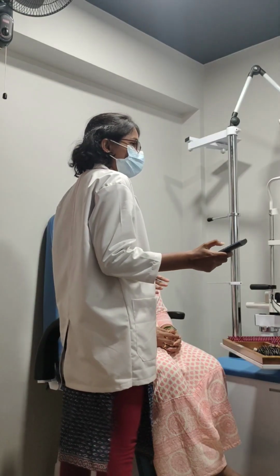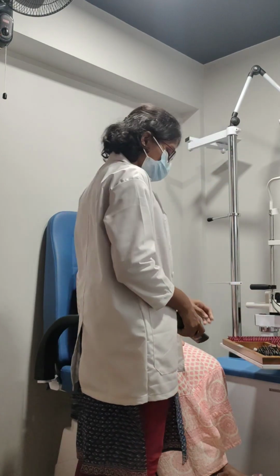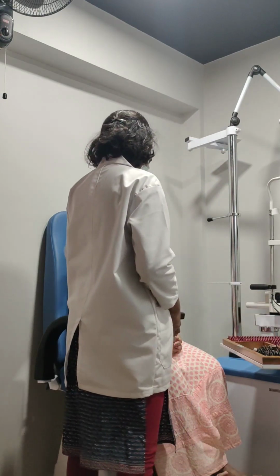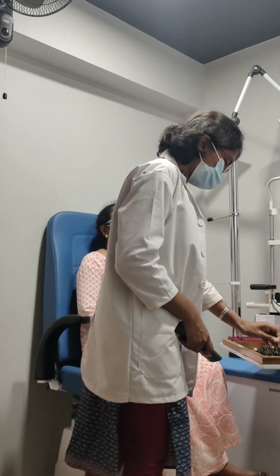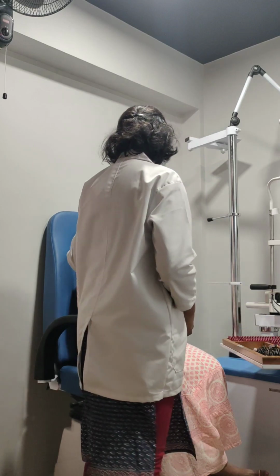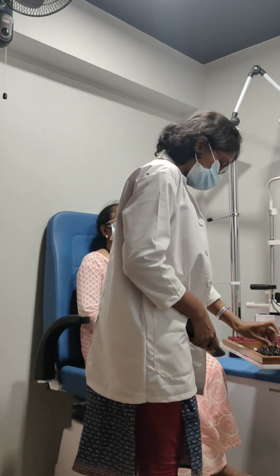After all the assessments are done, we have to do the refraction now. First, we have to do the distance refraction. We have to attain the best corrected visual acuity possible for the patient.